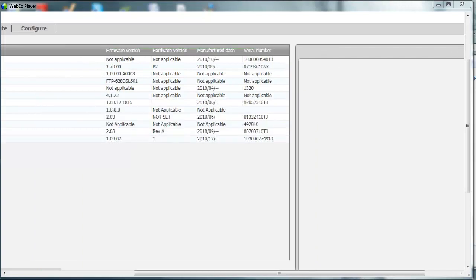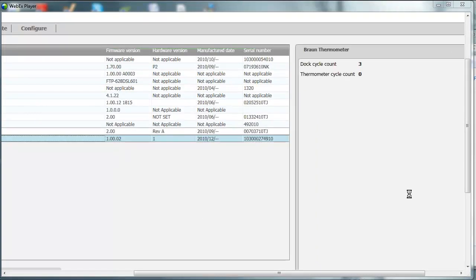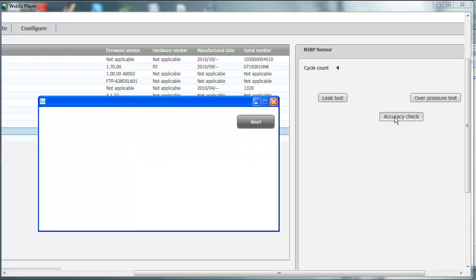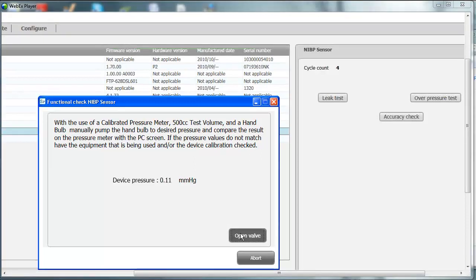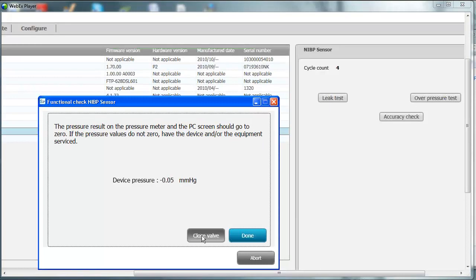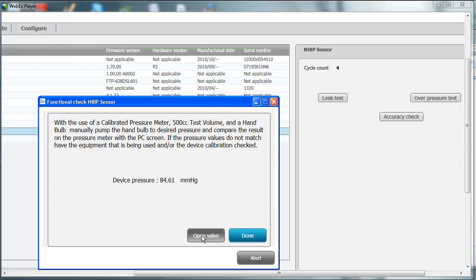Click Close. Going back to the NIBP sensor, you can perform an accuracy test. With the use of a calibrated pressure meter, a 500 cc test volume, and a hand bulb, you can open and close the valve on the device and pump the pressure meter to a specific value, then compare that value to the device to see if the NIBP transducers are within calibration specifications. Click Open Valve — the pressure result on both the pressure meter and PC screen should go to zero. Click Close Valve, pump to 100 mmHg, and compare. Repeat for 250 mmHg, then click Done.